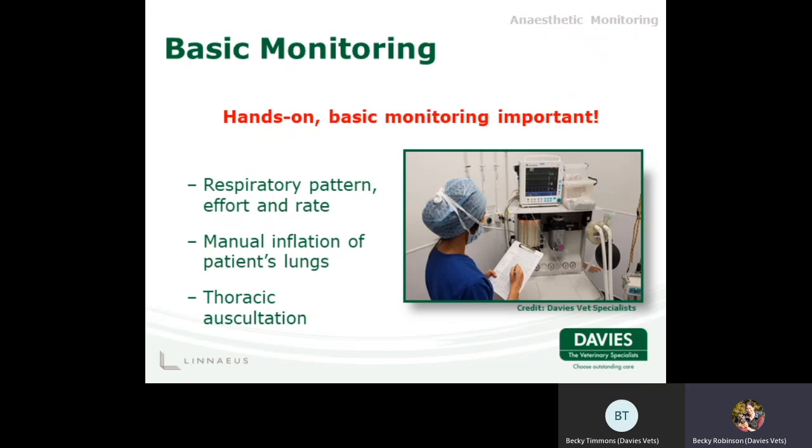Although this talk focuses on capnography, it is important to remember that basic hands-on monitoring gives valuable information. Occasionally, anaesthetic monitoring equipment will give artifactual information, and the basic monitoring is critical to distinguish this from what is really happening. In terms of the respiratory system, there are a number of things that we can do as part of our basic hands-on monitoring.